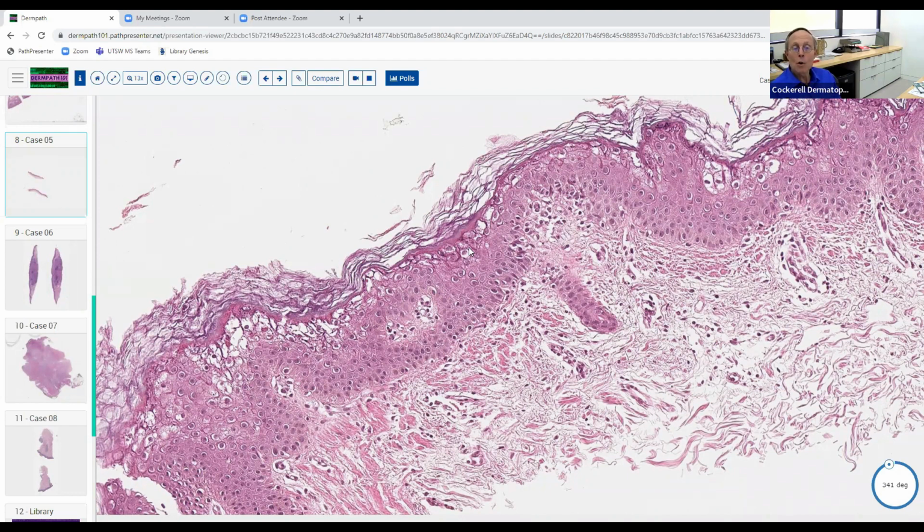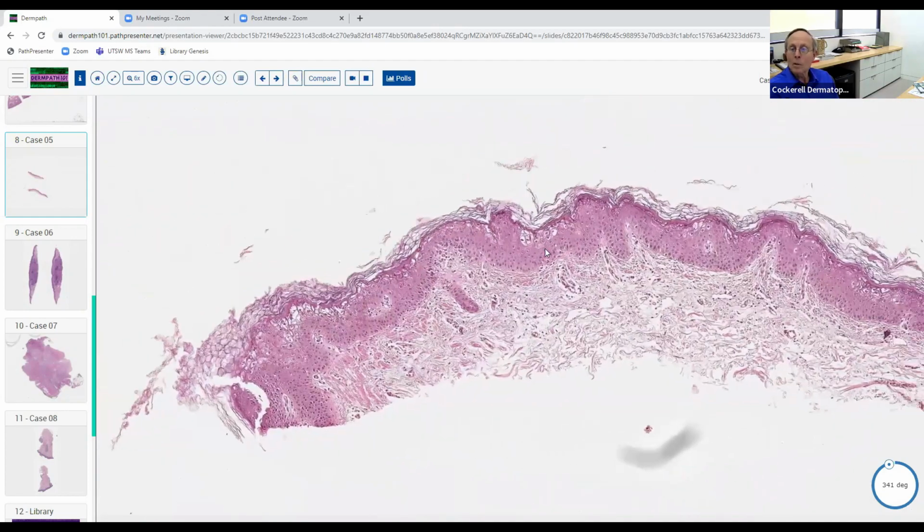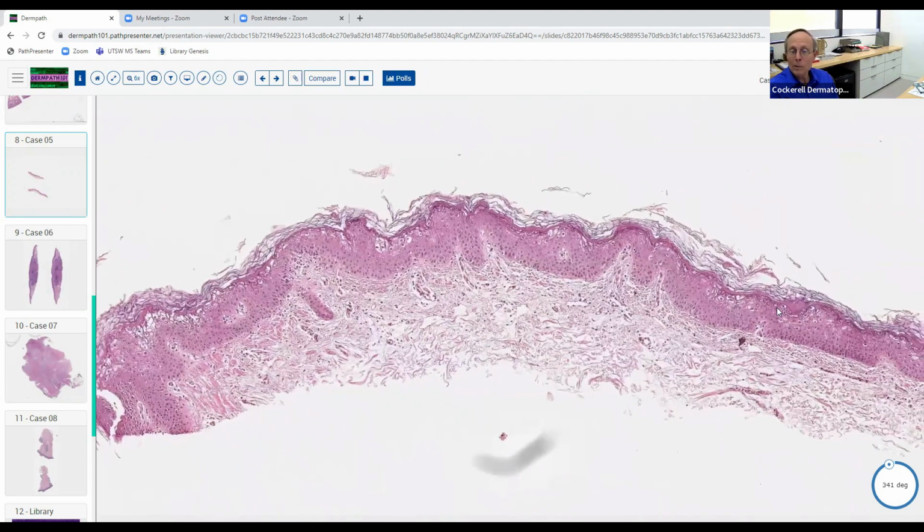So just make sure you know this pattern histologically, and know a handful of diseases that can be associated with that pattern. Very fair question to ask on the board, and then ask about the keratin gene mutation. So this is a very fundamental type of question. They're going to ask you about epidermal reaction patterns, about focal acantholytic dyskeratosis. We just had the pagetoid pattern, spongiosis, ballooning degeneration. So you're going to get questions about that. If I were writing board examination questions, which I used to do, I would put lots of questions on that, because it's really important to know. And it's something that is straightforward. There's no trick to it.